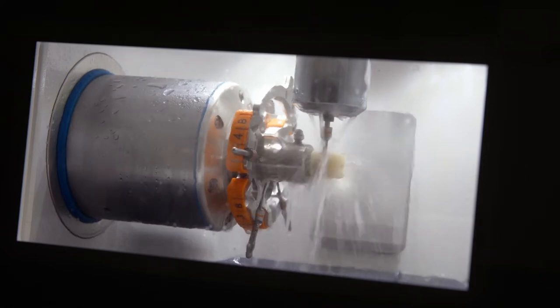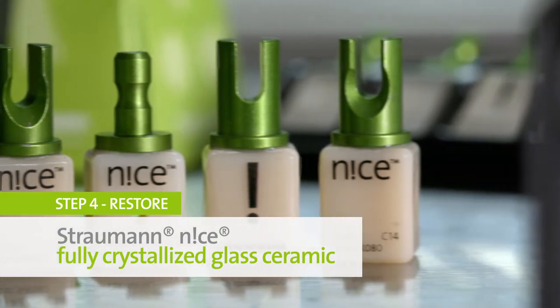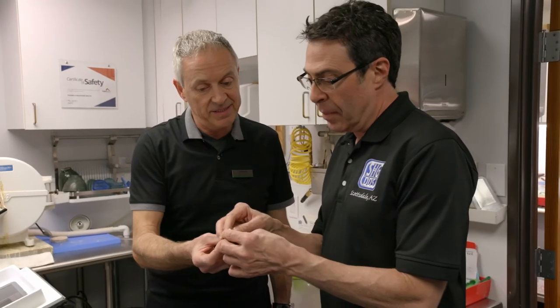I'm amazed how fast it is. I bet patients would love to see this — it really is impressive. So this is the nice material. It's a glass ceramic material, and that is the finished restoration.